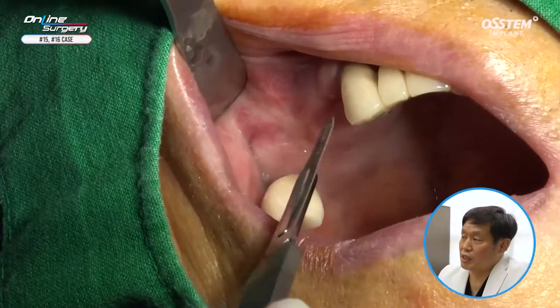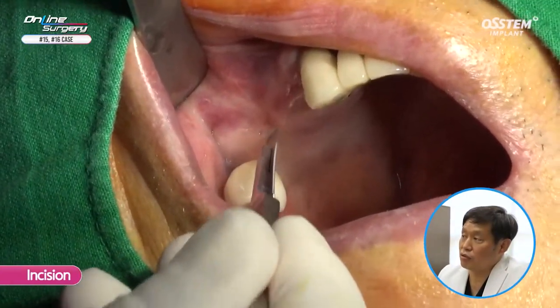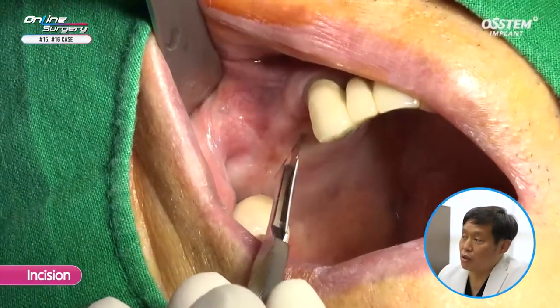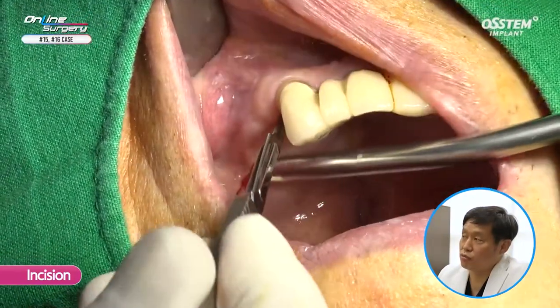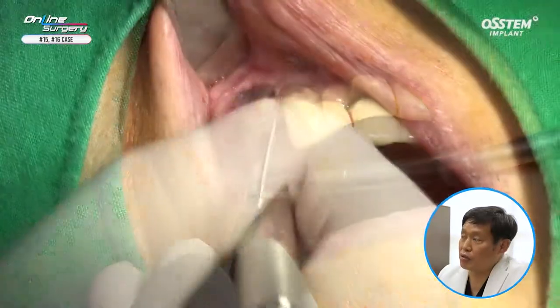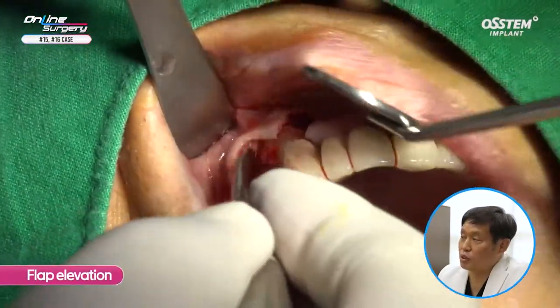Incision is being made. From the crest, I'm going to slightly make it inclined towards the palatal side. From distal to the mesial side, the incision is made like this. A vertical releasing incision was made on the mesial side, because we're going to do apicoectomy on the canine.